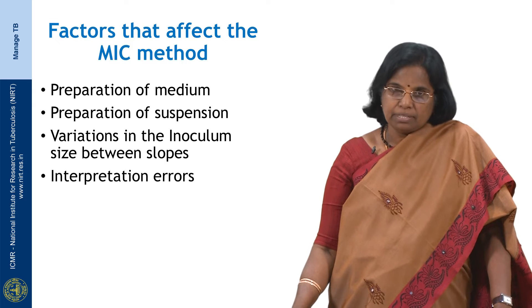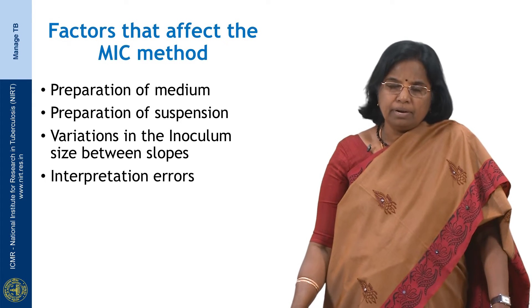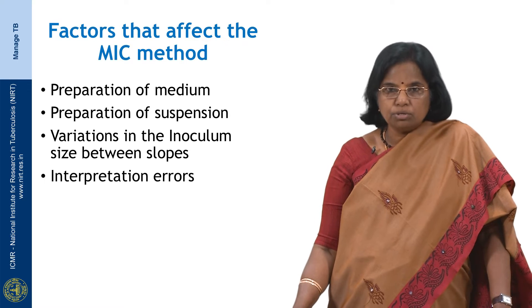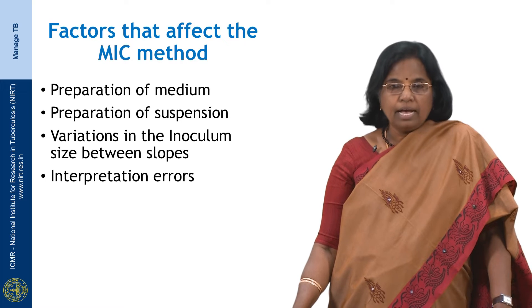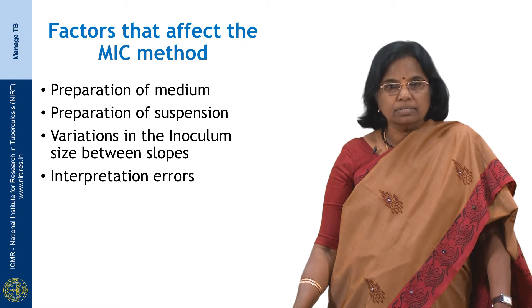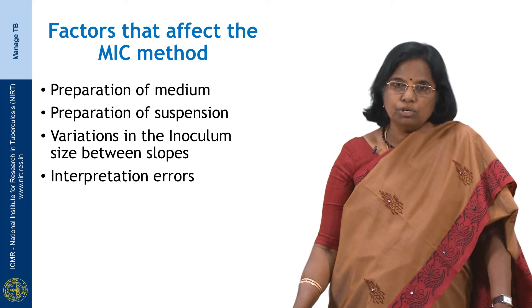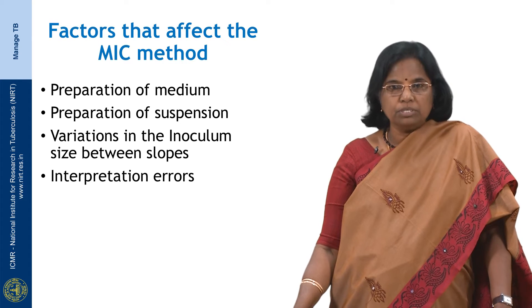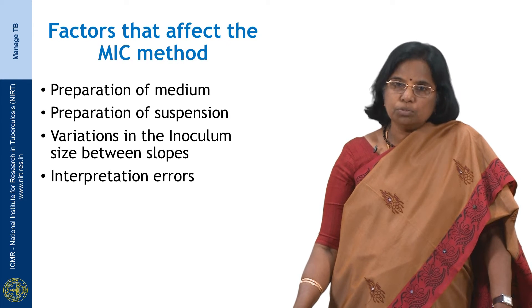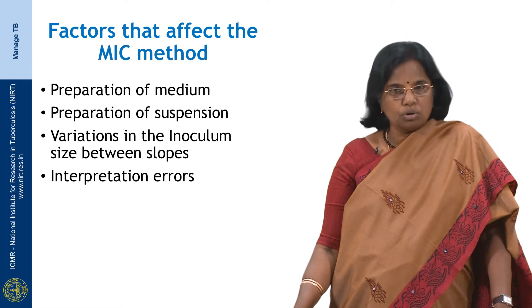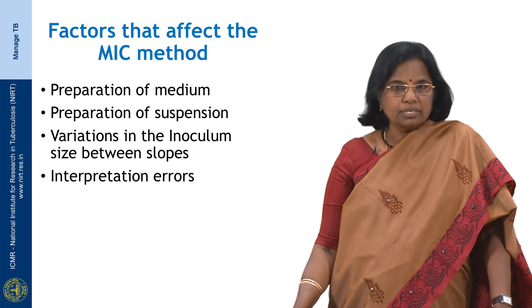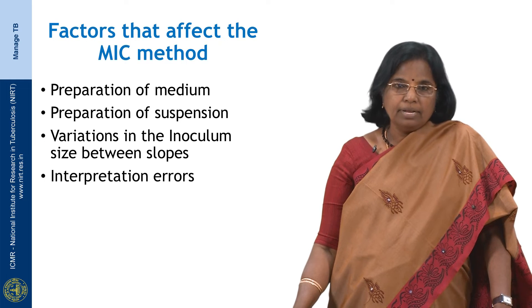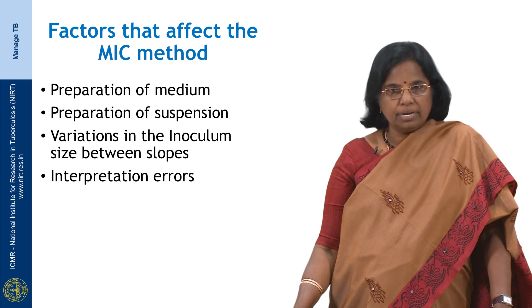The factors that may affect the MIC method are: first, preparation of the medium — a stock solution of the drug is prepared and dilutions are made to achieve different drug concentrations in the slopes, and any errors in preparation can result in erroneous results. Second is preparation of the suspension — a uniform suspension is required, and the presence of even a small clump can result in wrong results. Third is variation in the inoculum size between slopes, which can also affect the results. Finally, technical errors which could result in interpretation errors.